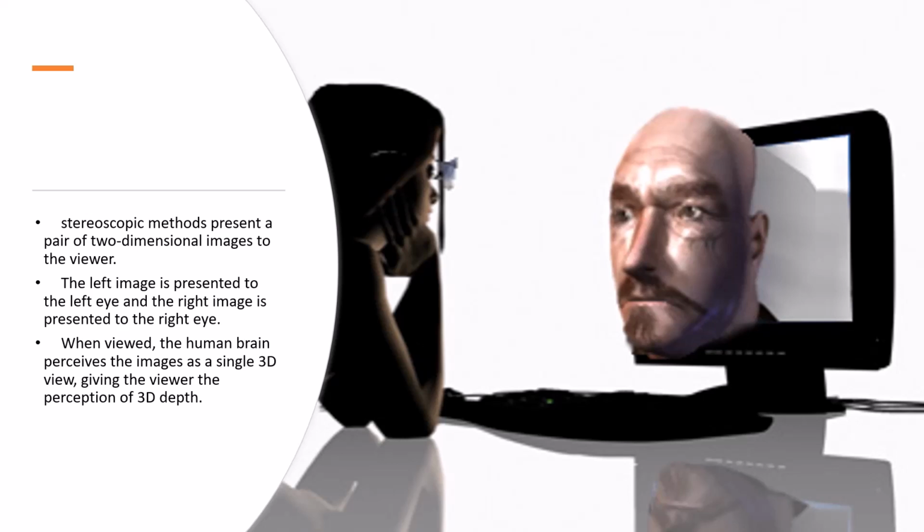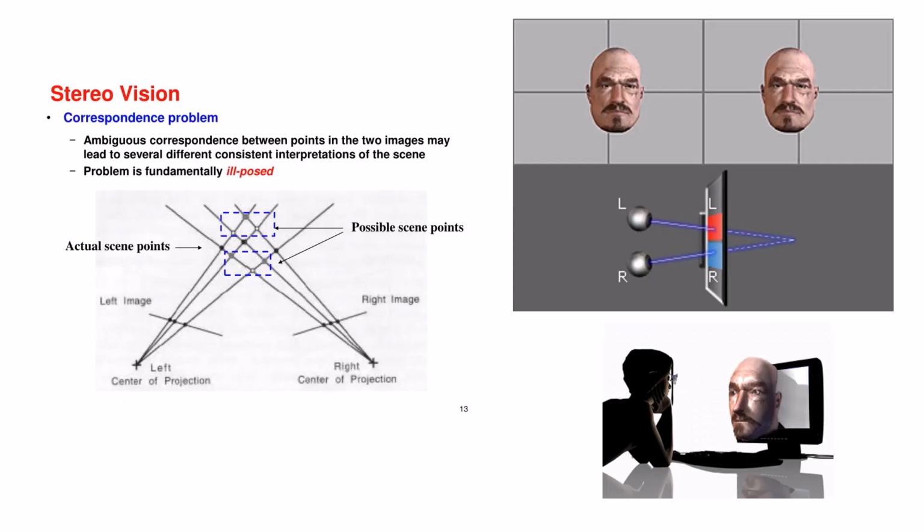We no longer use different angles when acquiring X-ray images to present a stereoscopic vision to the radiologist. Today, this is accomplished through algorithms and computerization of data. This graphic is a good demonstration of how stereoscopic vision is used and how it was used in medical imaging for stereoscopic X-rays in the past.